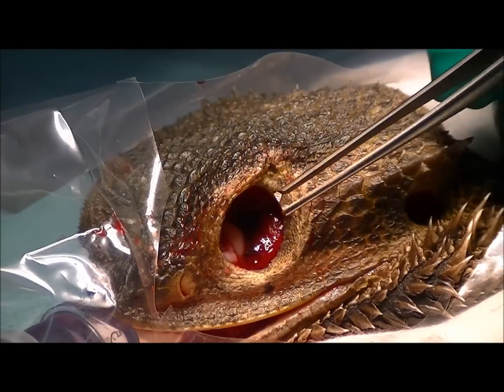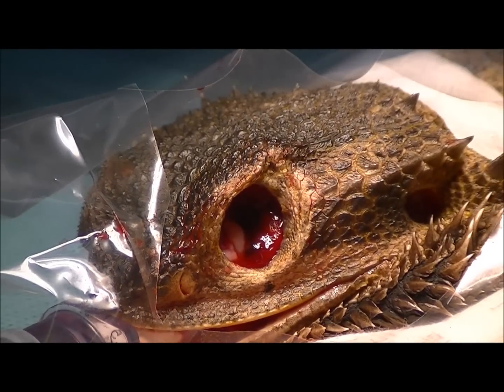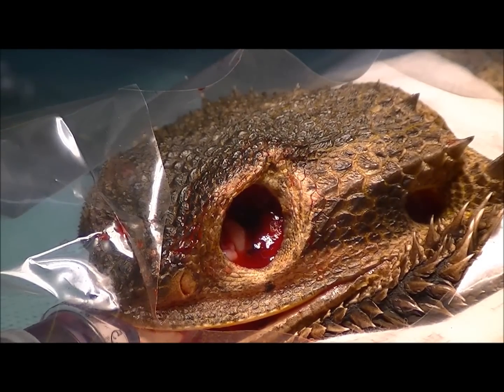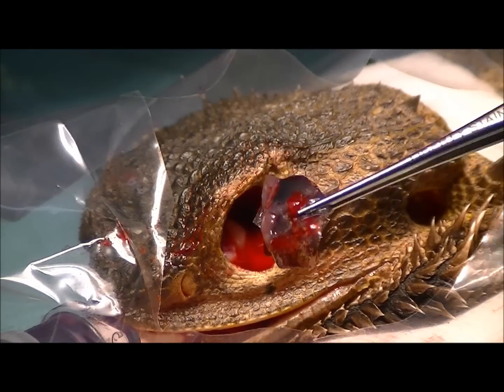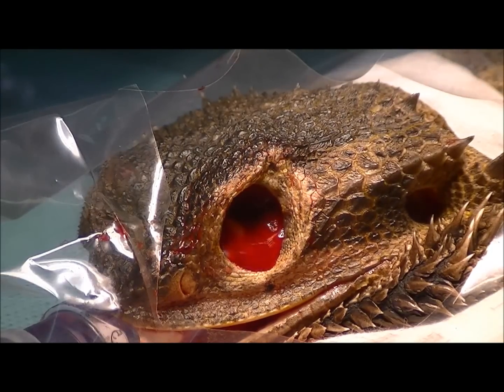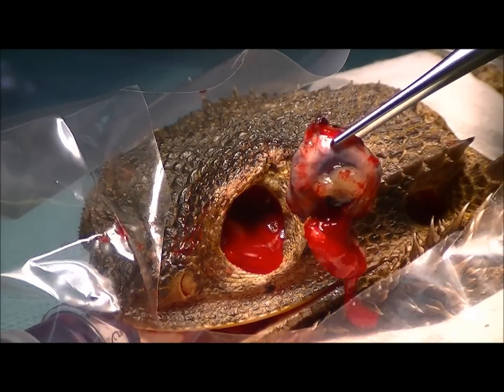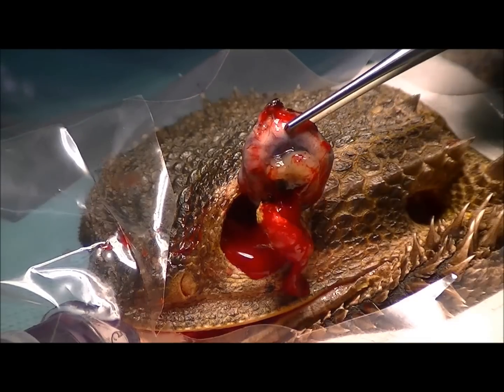We've got the eye out and you can see it's a pretty gruesome-looking hole. The eye itself came out relatively in bits and pieces — we've got bits of the actual back of the eyeball, you can see that it's pigmented black, and here's the actual front section. You can see that it ruptured through the front of the eye there.